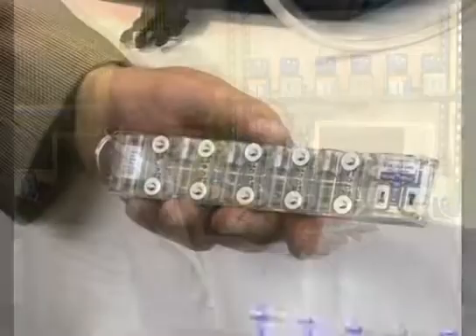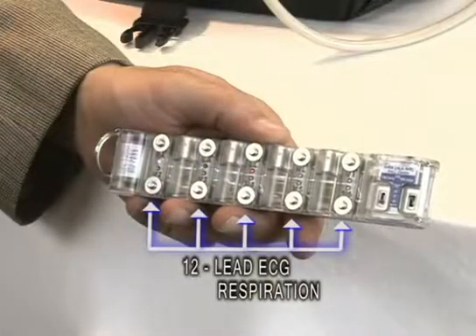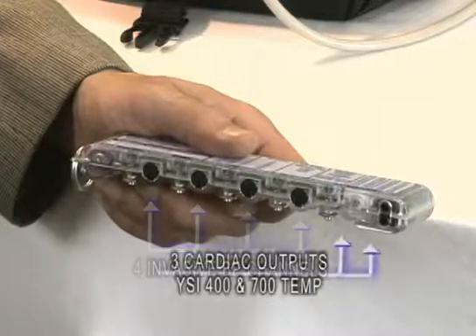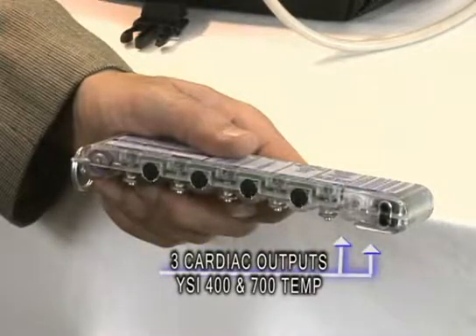The SimSlim multi-parameter patient simulator has ECG, respiration, four invasive blood pressures, cardiac output, and YSI 400 and YSI 700 temperature simulation capability, all in a package that literally fits in your shirt pocket.